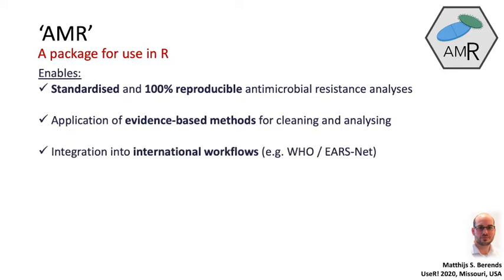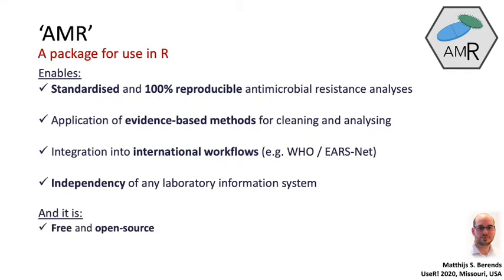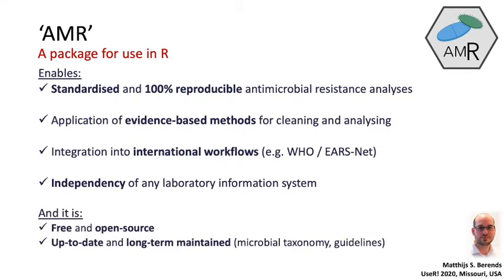You can also integrate it into existing international workflows like those by the WHO or EARS-Net, which stands for European Antimicrobial Resistance Surveillance Network, and it's completely independent of any laboratory information system. Besides that, it's of course free and open source. It's up to date and long-term maintained for the microbial taxonomy and the guidelines. We keep track of that. It's also independent of any other R package. It does not import any other R package, although it works very well with the tidyverse. I'll get to that. And it's stable and fast.